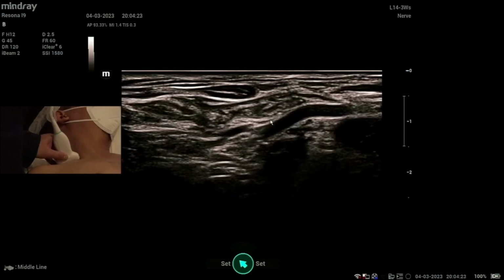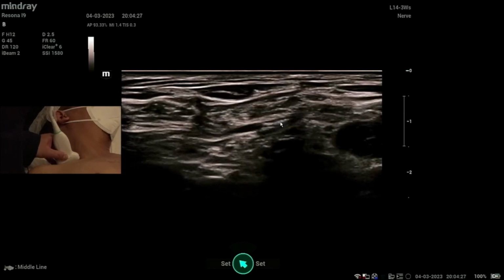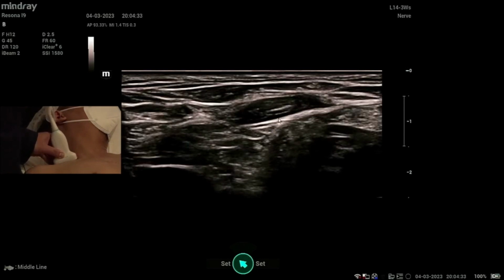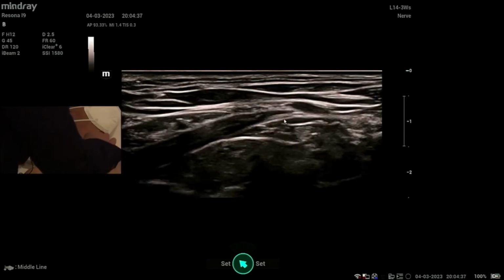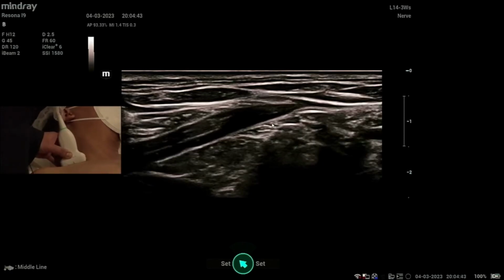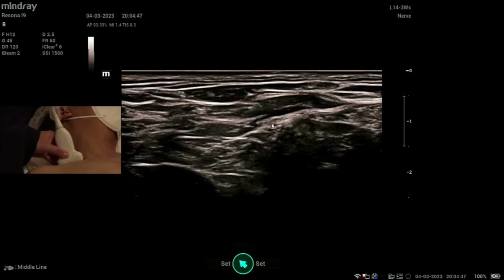So there's an artery there, right? Transverse cervical. And what we're going to look for is one of the nerves moving. You see the nerve moving laterally under the omohyoid. About there. Yeah. That's the suprascapular nerve moving outwards.